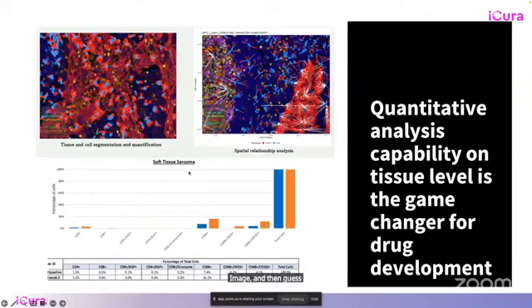And then guess what? At this point, some of these manufacturers already have AI-enabled software that can go in and take all these multiplex immunofluorescence digital images. These are whole slide images, and the AI does the so-called tissue and cell segmentation. What that means is, if you see this image on the left upper panel, where all this blue and red are artificial labels applied by this AI-enabled software, it tells you which color represents a certain cell type. This yellow is a different cell type, and then what are their distribution and their borders with each other.